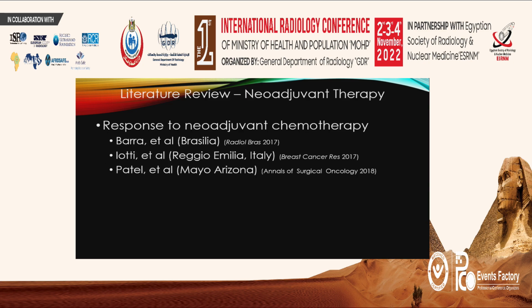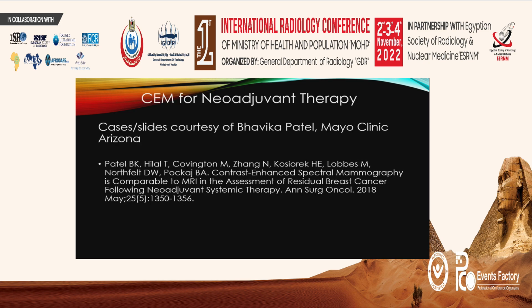There have been several papers looking at diagnostic uses of contrast mammography, and one of these I'd like to highlight is neoadjuvant therapy monitoring. So 3 papers at least have come out looking at contrast mammo for neoadjuvant chemotherapy monitoring. It is attractive because you would expect it to be quite good, and it would be lower cost than MRI. One of the papers was by my colleague at the Mayo Clinic in Arizona, Bhavika Patel, and she shared some slides with me, which I'll show you now.